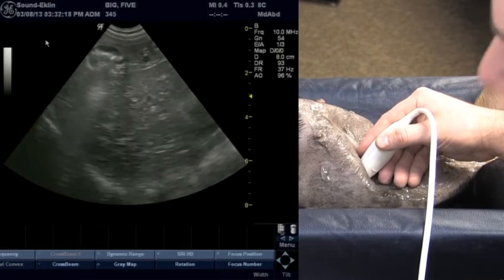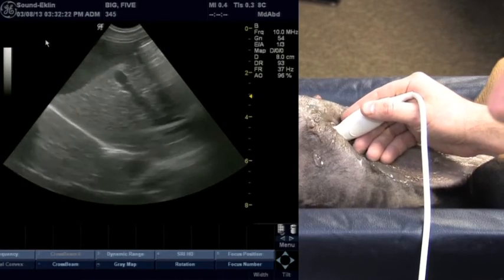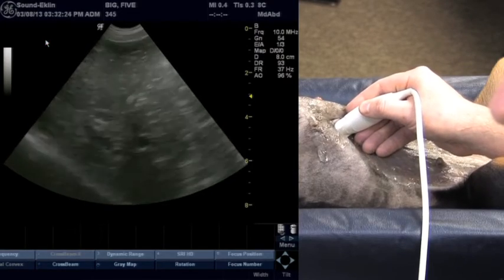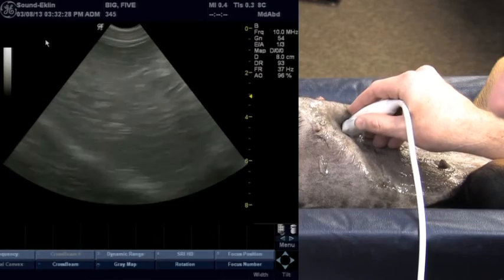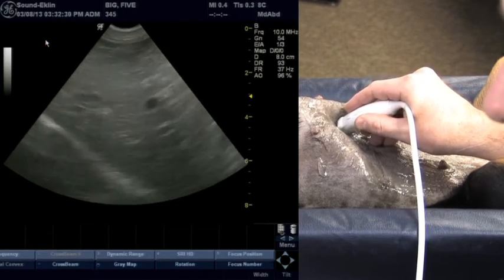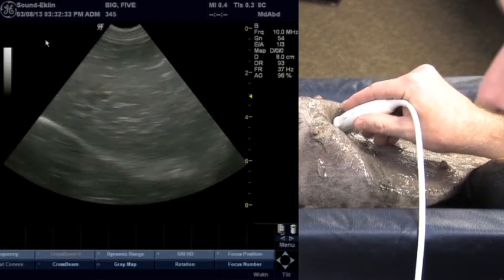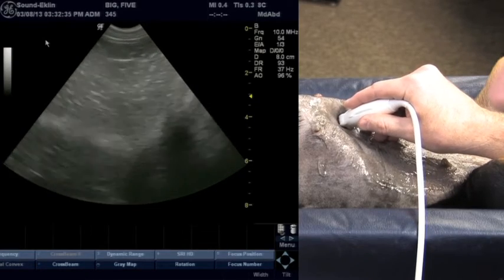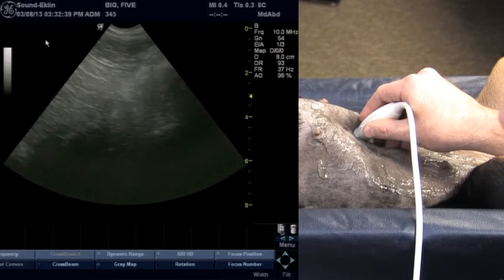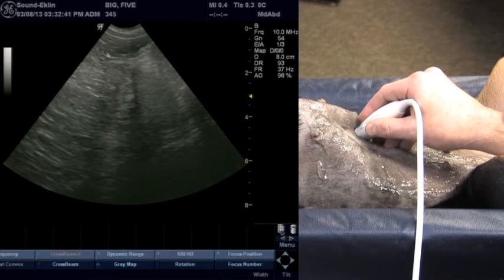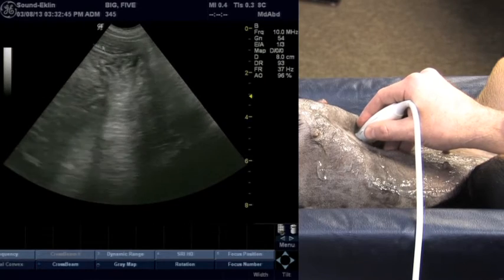At this point, continuing in a sagittal plane, we go back up towards midline, again picking up the gallbladder, and then sweep over towards the left side. The probe is now along the left thoracic wall, slightly tilted to angle underneath the ribs to evaluate the left lateral liver lobes. We continue until we either run out of liver or encounter stomach and spleen.